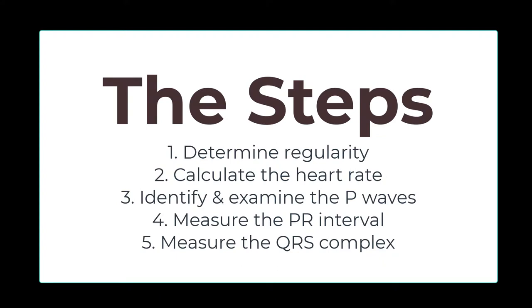In summary, there are five basic steps that you must follow in order to analyze a particular ECG strip. If you develop a habit of doing this systematically, then eventually this will enable you to identify the appropriate rhythm or interpret the ECG strip accurately. That concludes our discussion on analysis of an electrocardiographic strip.